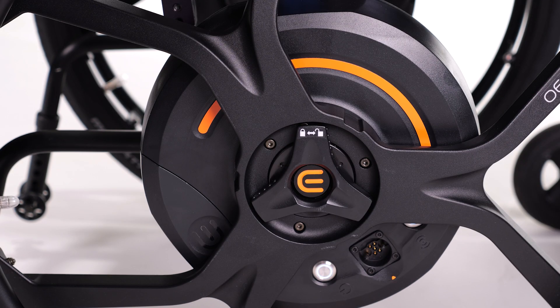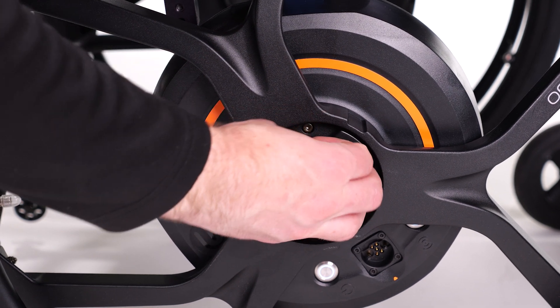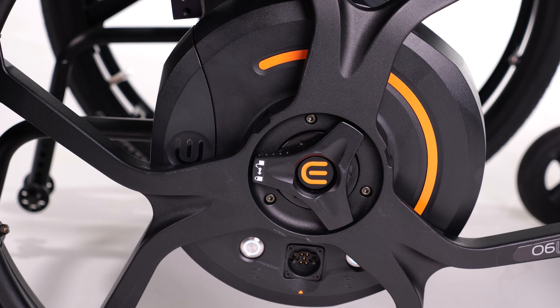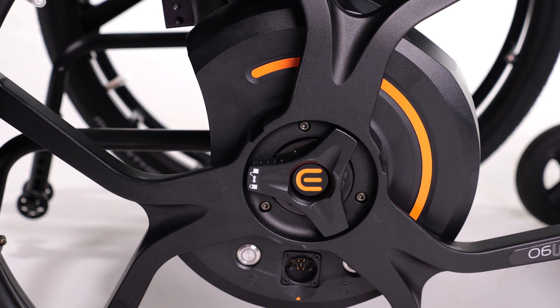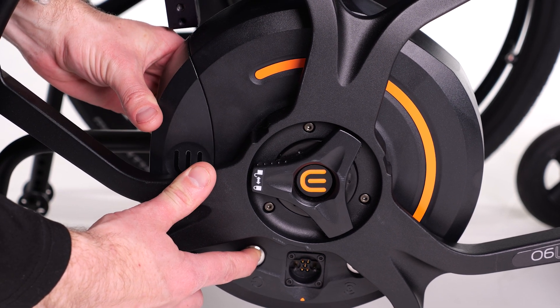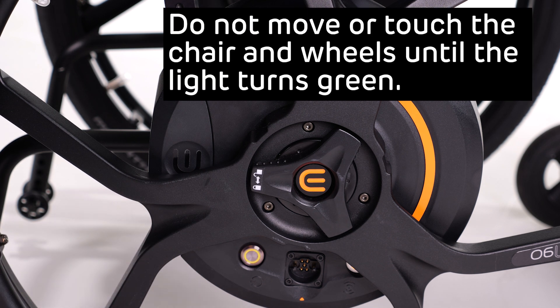Before driving the M90, make sure that the wheels are properly calibrated. To do so, rotate the engagement switch to engage the wheels and spin the wheels until they are engaged. To initiate the calibration, remove the battery, hold either button on the wheel, and reinsert the battery. The light will turn orange, and during this process you do not want to move or touch the wheelchair or the M90 wheels.